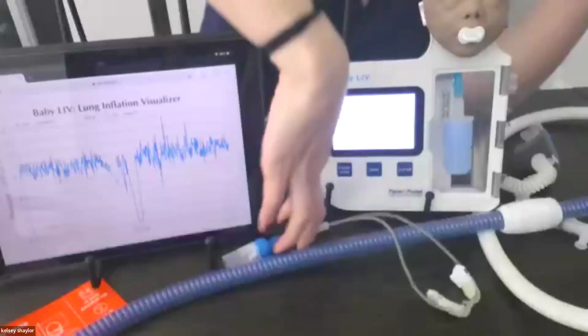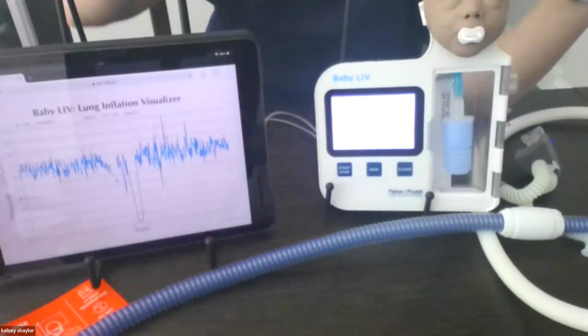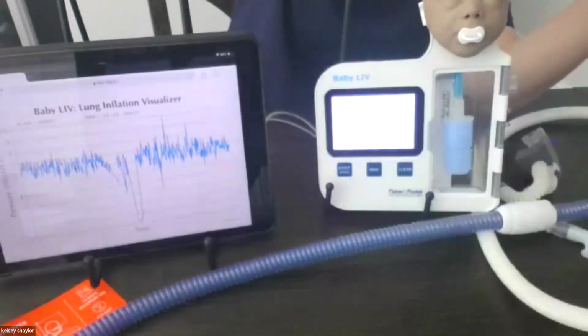So with CPAP, we're very consistently hitting between 6 and 7 centimeters of water. And even with Kelsey manipulating that lung to put a bit of forced expiration in there, we're still not seeing the PEEP climb above 7 centimeters of water. Correct. So now what I'm going to do is I'm going to go ahead and remove my expiratory limb. I'm disconnecting my bubbler. I did save that line, pardon the drastic drop there in the middle, but that's what happens when you have a leak.